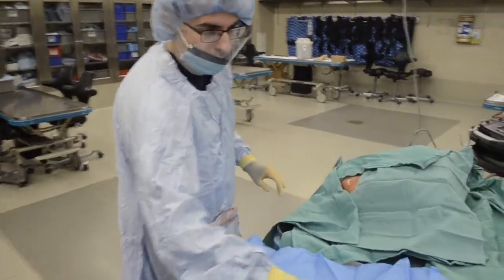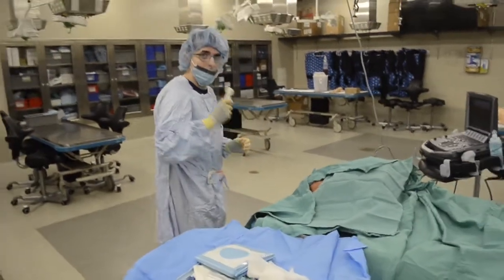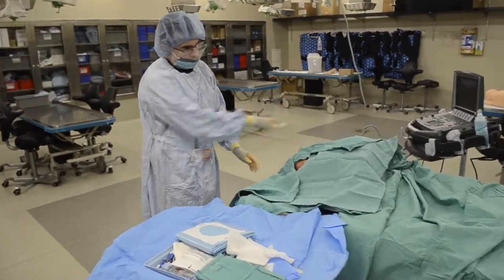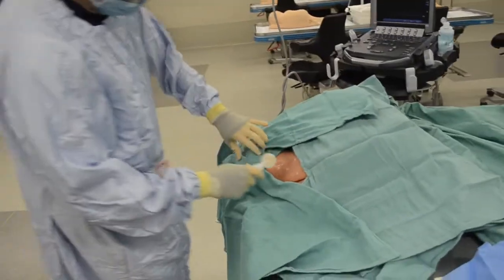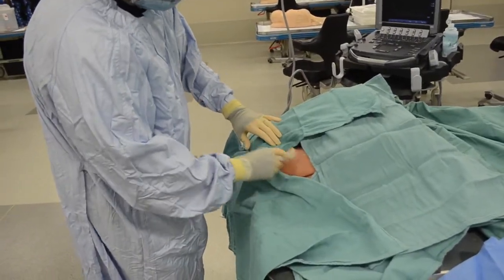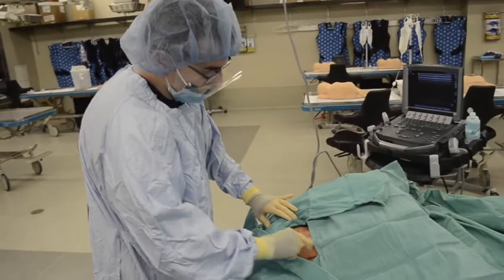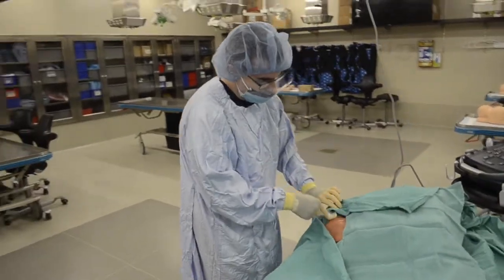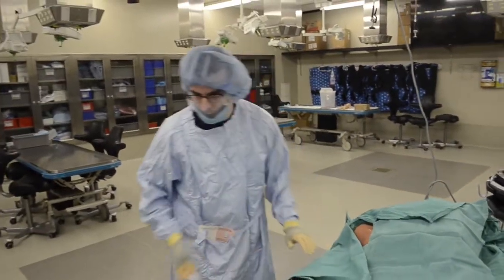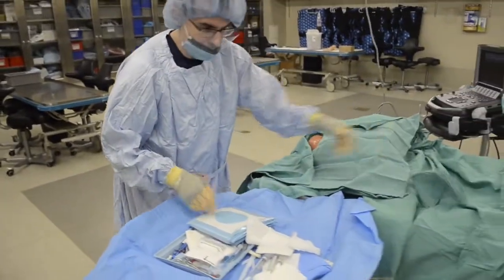We'll clean one more time with the chlorhexidine. And Richard, how many small towels did you use right over there? I used 4, and I made a little diamond. And set this extra towel aside.